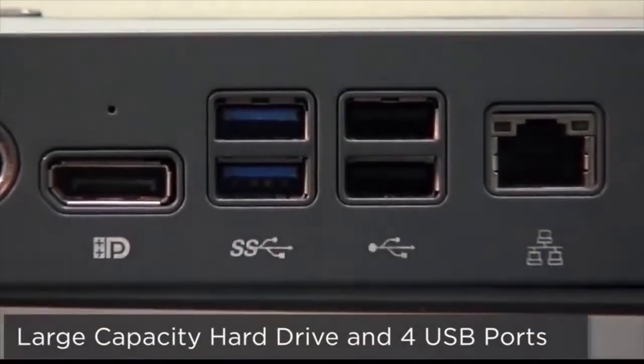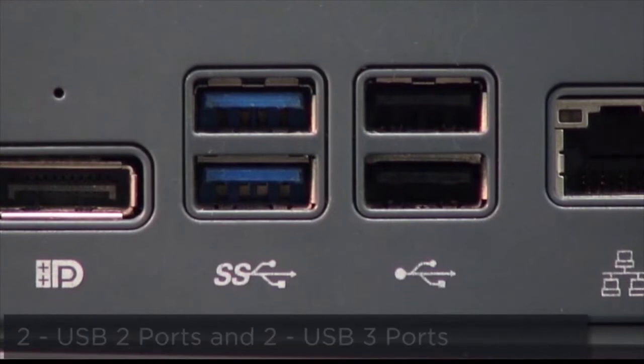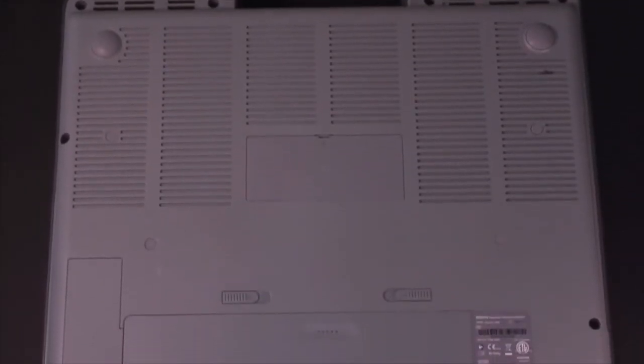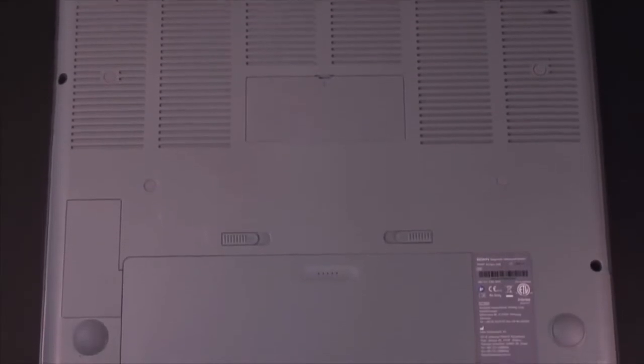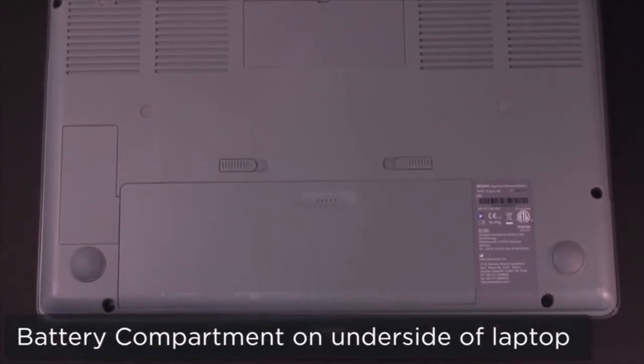The Eclairix AX8 features a large capacity hard drive and 4 USB ports — 2 USB 2 and 2 USB 3 — to facilitate archiving of images and transfer for permanent storage. Additionally, the AX8 features battery operation of approximately 60 minutes of normal use, allowing you to move easily from room to room for maximum efficiency.